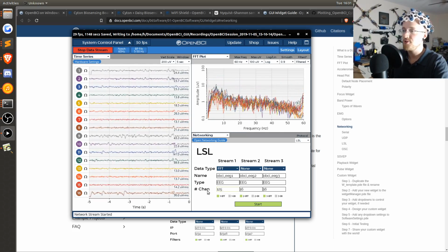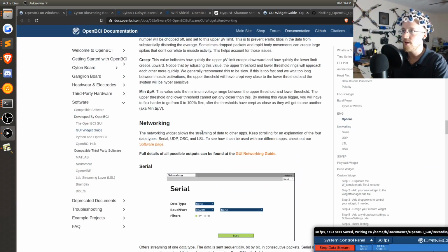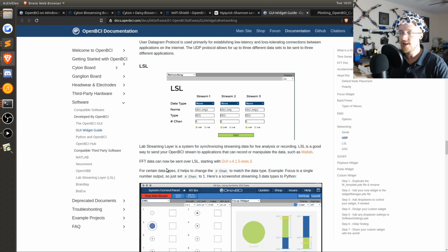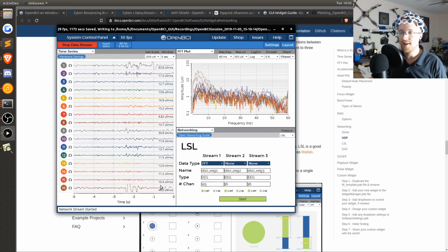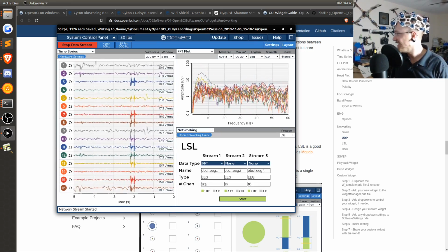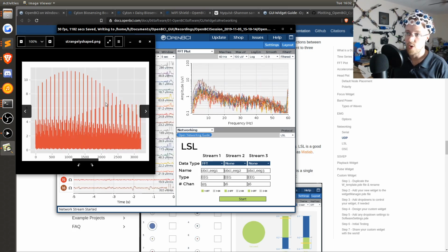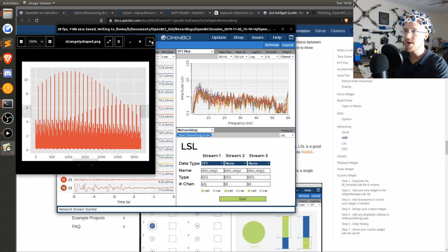But initially I threw 16 in here, and it just really wasn't clear to me. So if I go over here, it just says FFT can now be sent over LSL, which is cool. Then it has some information here about how for certain data types you want to change number of channels to match the data type, but I wasn't really sure what that was talking about. So I threw 16 in here and I had a really hard time figuring out what was going wrong. Basically I was getting data that looks like this, which doesn't look like this at all. It's very clear there's either wrapping going on here or it's multiple data sets, but I couldn't figure out what was going on there.